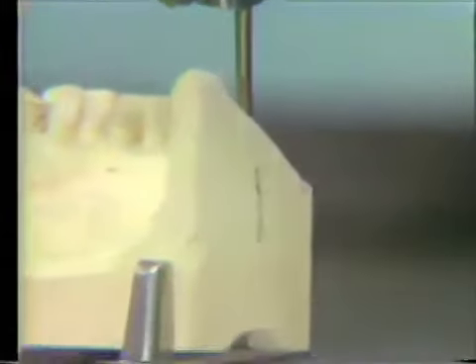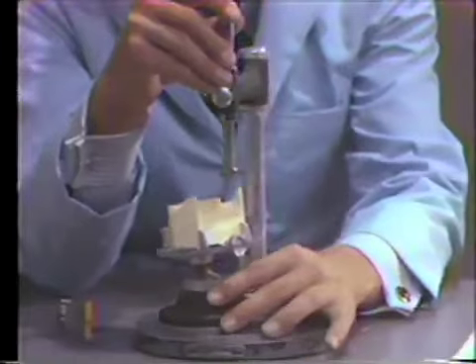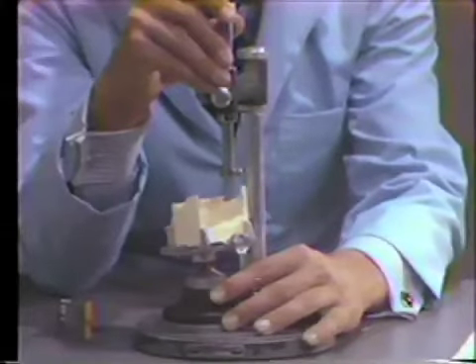Now we can't use an analyzing rod or one of these graphite rods forever because it'll go out of round and we will no longer be getting an adequate representation of the undercut. But for this purpose, I'm sure we can use one rod for this case all the way around.